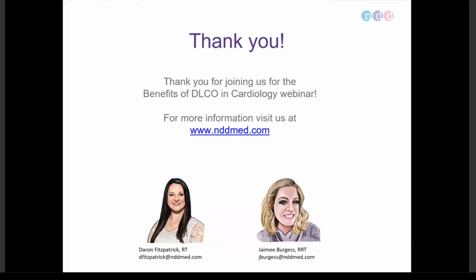Absolutely. And with the device, a calibration question did come up. You are able to check calibration on our device, just so we follow ATS guidelines, which recommend calibration checks. You can use a 3-liter cal check, but we also have a feature called True Check, where our device does a 5-point cal check before every single DLCO.